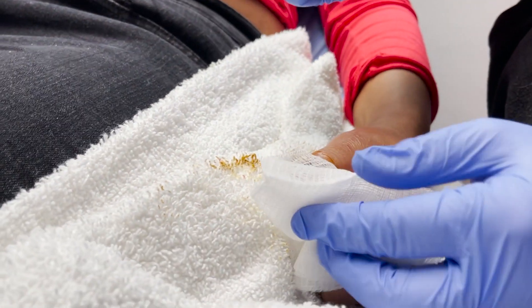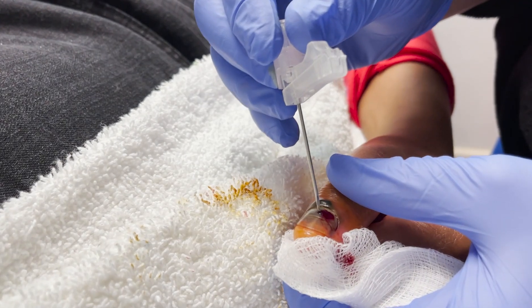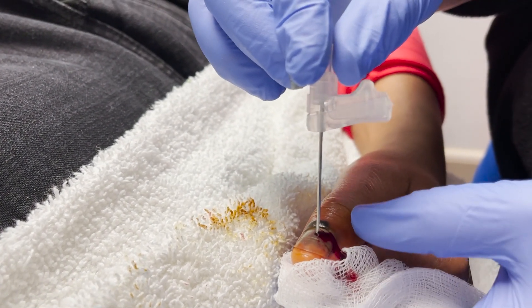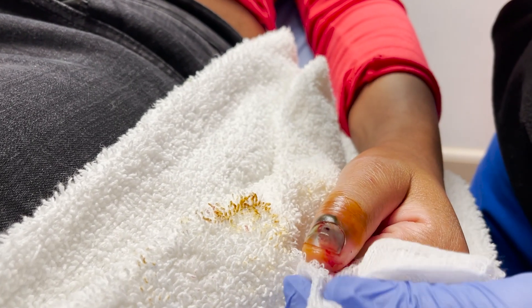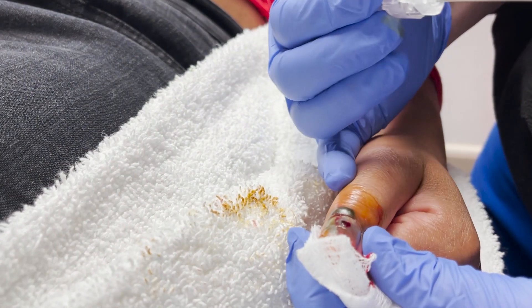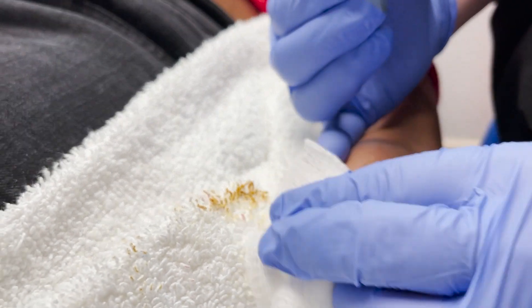You just kind of spin it. There you go — see the blood coming out of there. The goal here is just to make your hole a little bit bigger. Obviously you don't want to be going into the nail bed. You're getting good blood flow now, so go ahead and squeeze that.